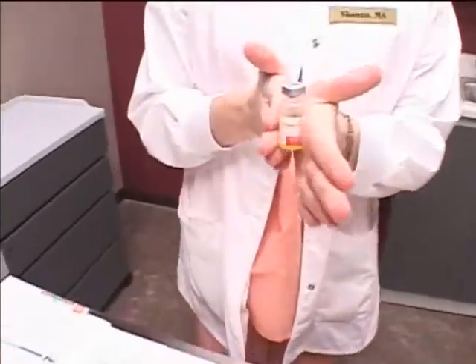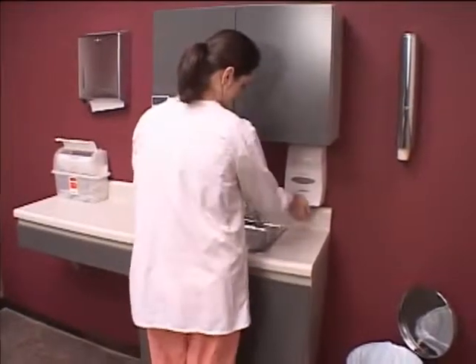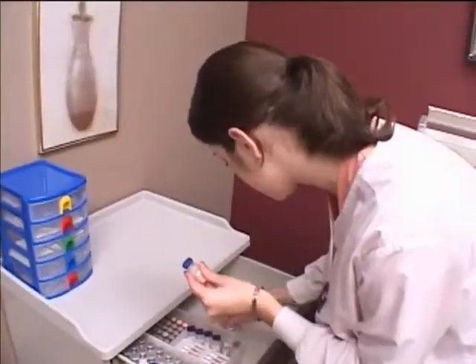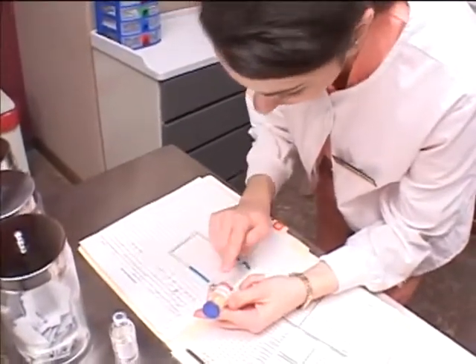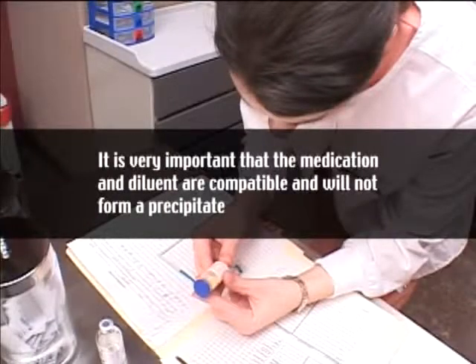When ordered to reconstitute powdered medication for administration, you should begin by washing your hands. Select the appropriate diluent and powdered medication vial and prevent error by verifying it against the physician's order for the 6 rights. It is very important that the medication and diluent are compatible and will not form a precipitate.